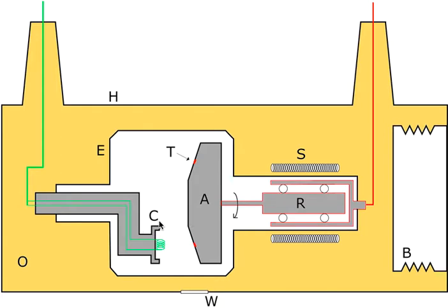They're conveniently labeled C and A here. We have the filament which has the electrons, and the filament is heated. We technically boil off electrons of this filament and they're accelerated through this potential towards the anode.